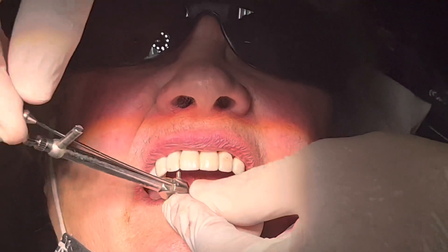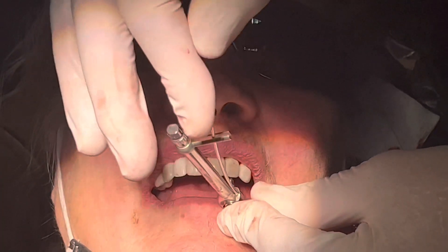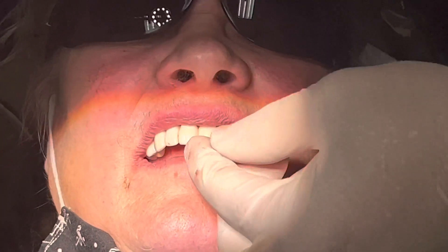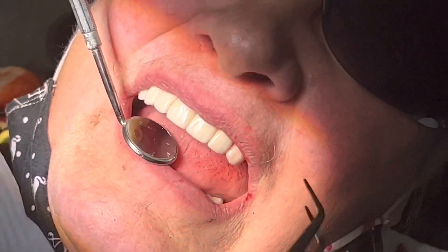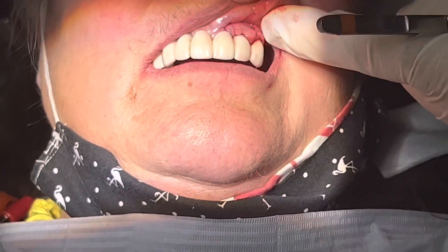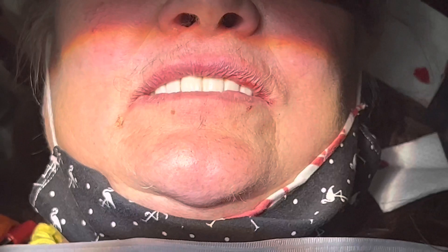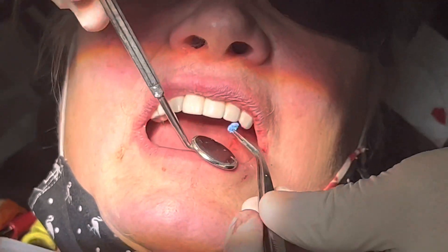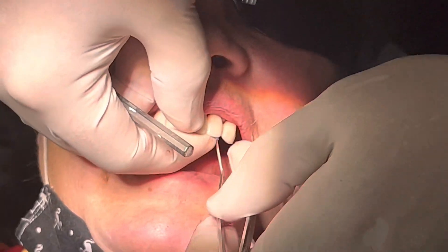Let's tighten this down — we'll take the torque wrench and tighten it down to 35 Newtons. This will enable us to get the stretch on the screw which will position the implant. This patient is still going to have to deal with their problem; it needs to be written in the chart that they need more teeth to support the posterior, otherwise this is going to happen again. We'll put some gut sutures in — this patient comes a long distance and that will be more than adequate.